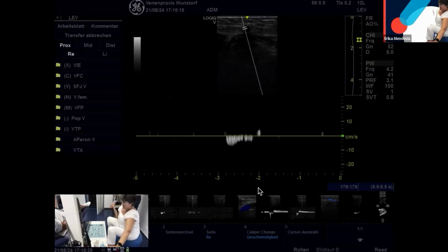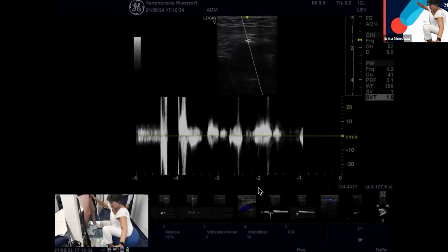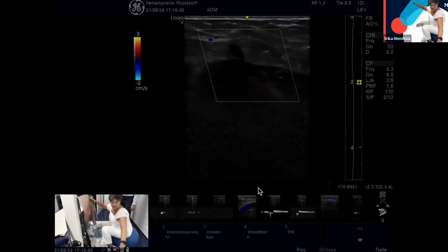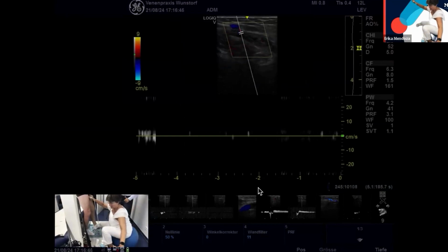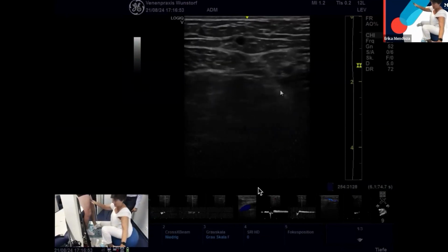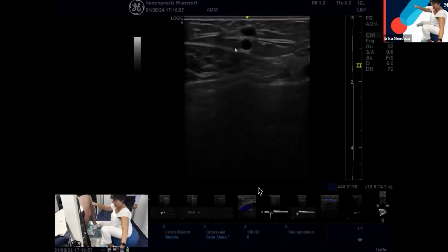And now we go back on the great saphenous vein, which is so tiny and expands. Now there is no reflux, because, believe me or not, it is healthy. So we go down, down, down, and look what happens. We go down the great saphenous vein. You see here the fascia. Perfect. And what is this?